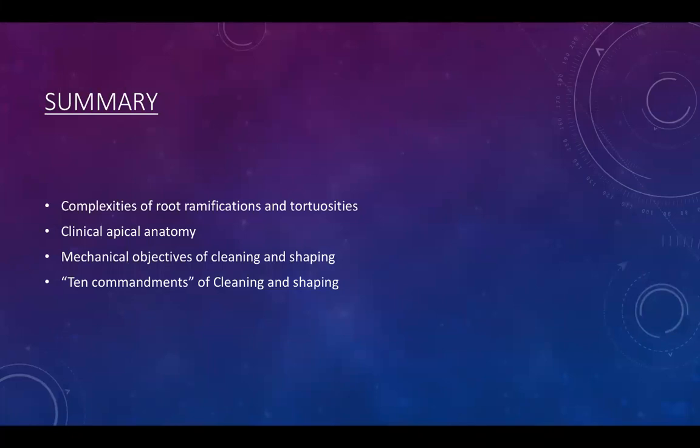But before we get our rotary in, make sure that you have your canal patent. Make sure that you can get a hand file to navigate that canal before getting any rotary file in. Something else, if you're preparing your canal with a hand file, remember that the taper of the hand file is 02. And the cones have to be 02, because if you're using 04 or 06, because of that taper, the cone will not reach your working depth. I hope I answered that question quickly.